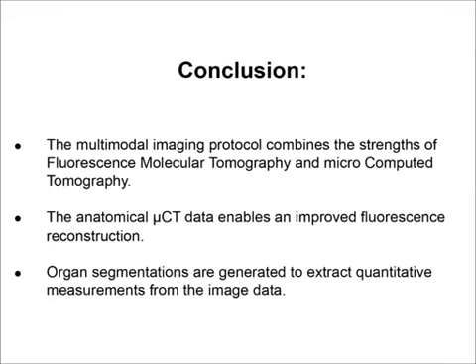In conclusion, we show a multimodal imaging protocol to combine the strengths of fluorescence molecular tomography and microcomputed tomography. The anatomical µCT data enables an improved fluorescence reconstruction by using the shape of the mouse. Furthermore, it is useful to generate organ segmentations which are needed to extract quantitative measurements from the image data.